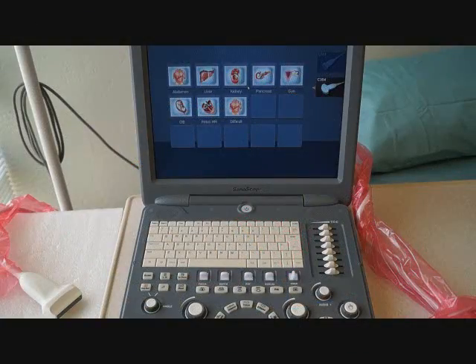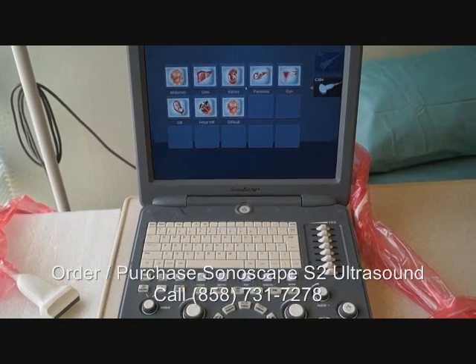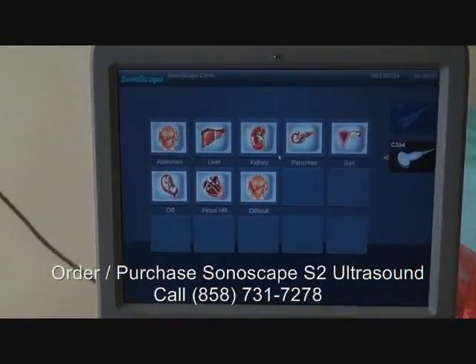This is the Sonoscape S2 portable color ultrasound, and it has a lot of functionality. It's very popular for OBGYNs when you need Doppler and color pulse wave Doppler — this machine will have that. It has all the preset and calc software built into it.